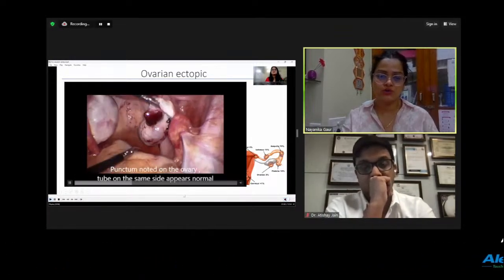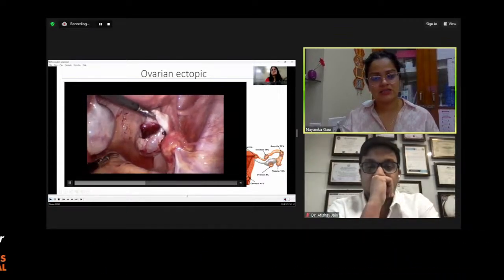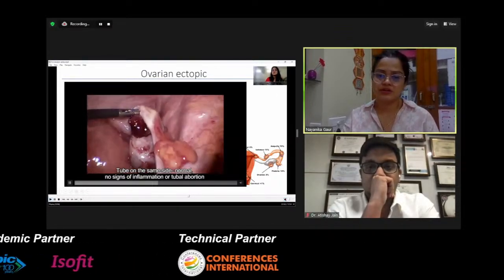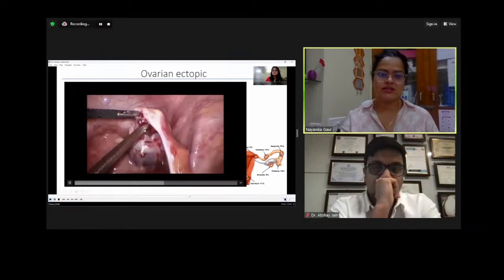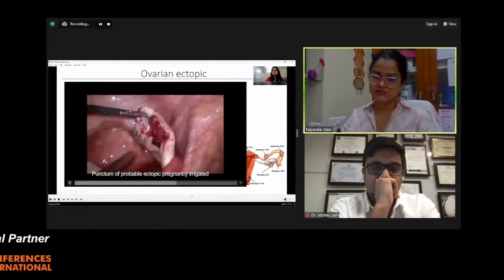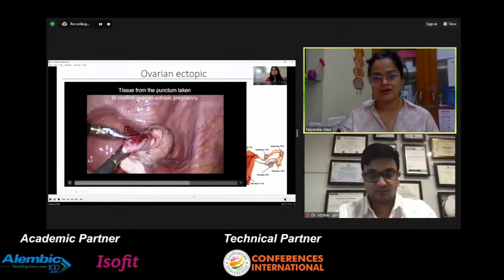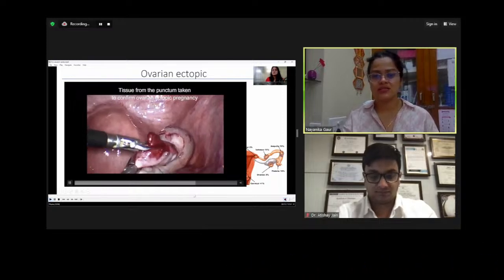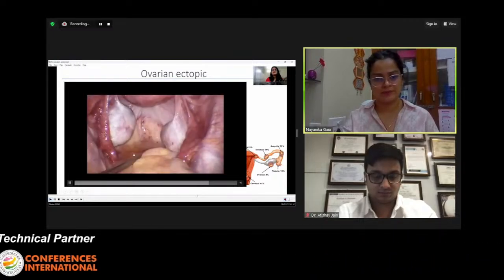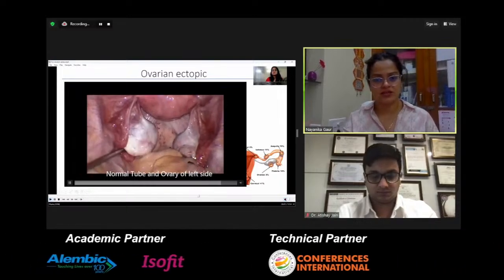But as we uplifted the ovaries, we saw a small punctum on the ovary. This kind of a picture is sometimes seen in a ruptured corpus luteum cyst also. But since this patient had a positive beta HCG, we decided to take some tissue out of it. We irrigated this punctum and we took out some tissue, and once it was sent for histopathology, it confirmed pregnancy tissue. So ovarian ectopic pregnancy, in certain cases, is actually confirmed with a histopathological examination only. Rest everything was fine. We also did a chromopertubation test for the tubes, and everything else looked perfect.